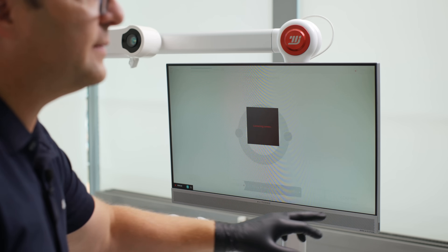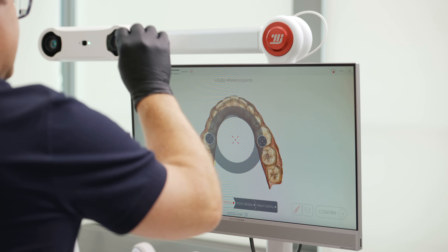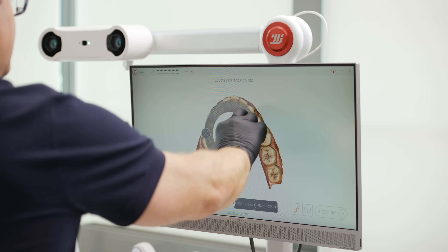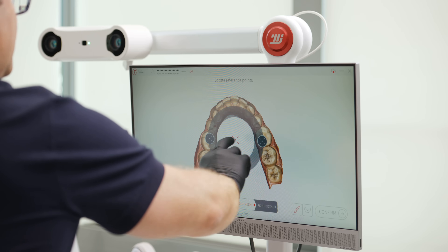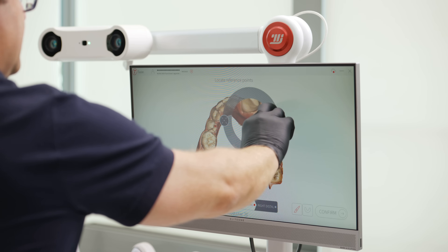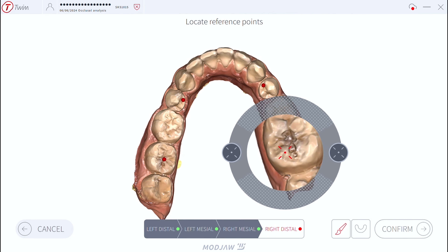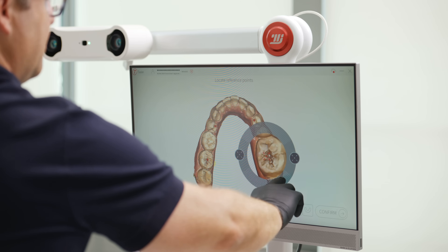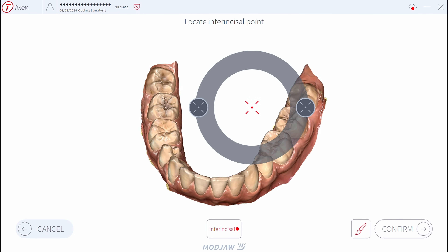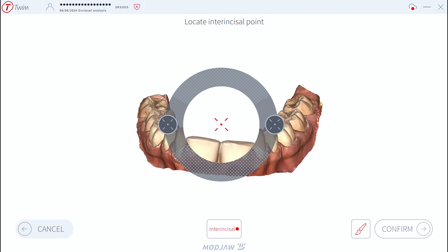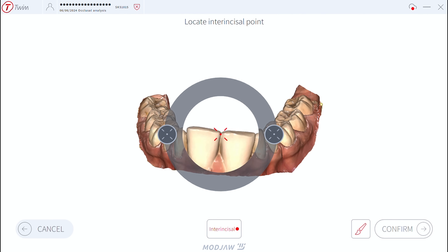In the next step, the reference points are being selected. Let's start with the molar — the occlusal central fossa of the 36, then the anterior fossa of the 34, the anterior fossa of the 44, and the occlusal central fossa of the 46. Finally, the incisal point has to be defined. And that's it.